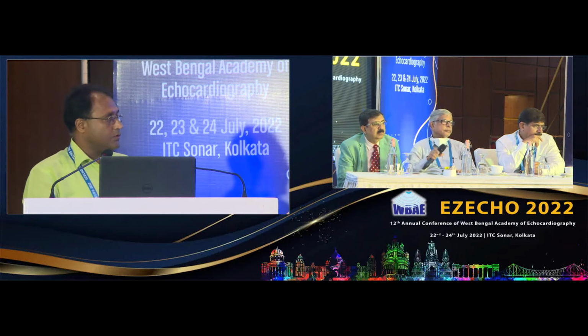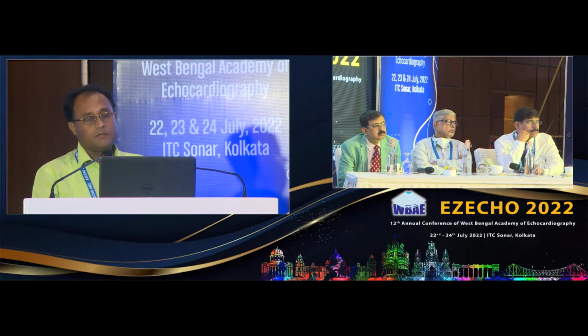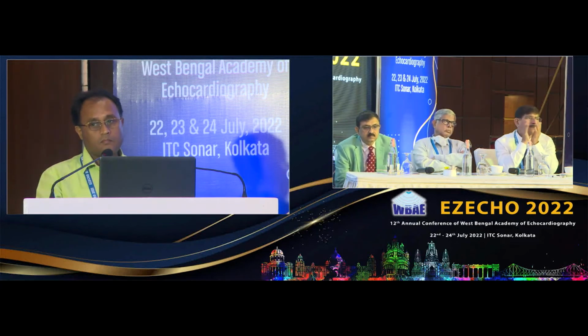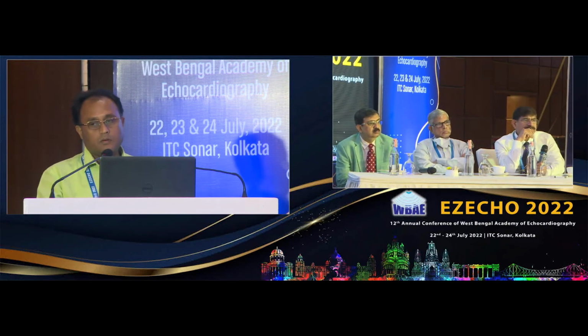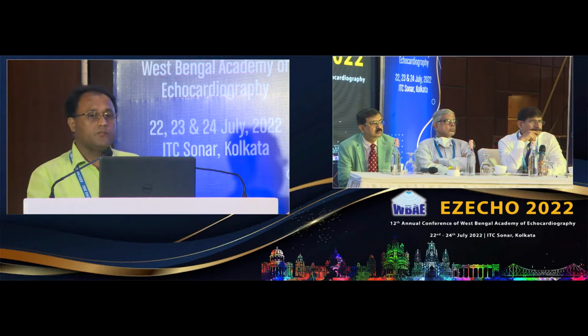Yes, sure, Devdatta. Just make a quick comment or question. From the images that were shown, I felt there was a straddling of one of the valves. The valve on the left had a straddling with the tip of one of the leaflets attached to the septum. The second point was that the aorta was arising entirely from the RV. So it would be more of a DORV with straddling of the AV valves and maybe pulmonary stenosis, because we couldn't see the RVOT properly. Or it could also be DORV with TGA. We are not sure because we haven't seen the outlets properly.